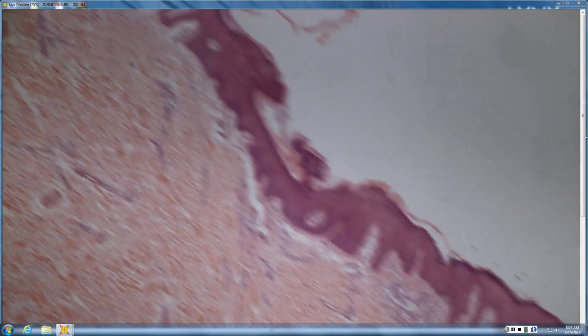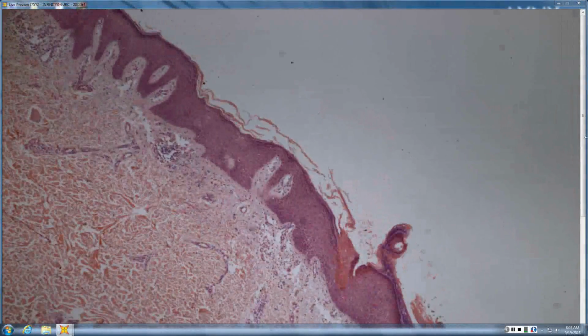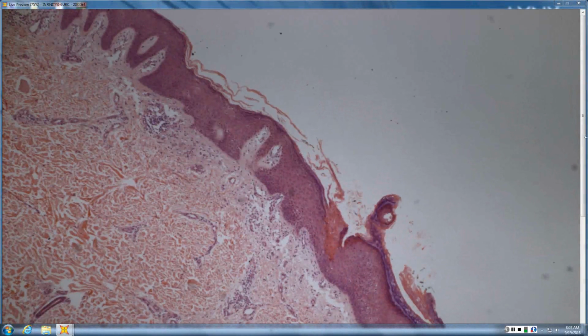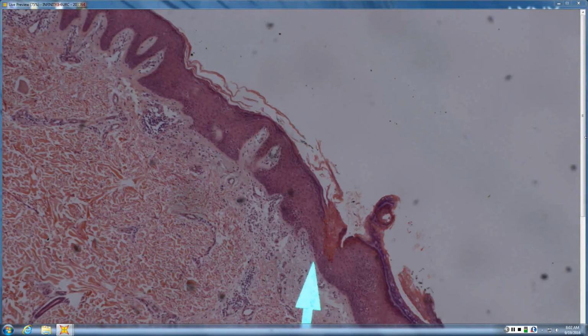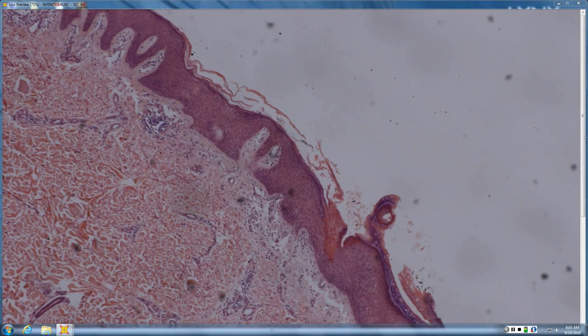Looks like a pretty big specimen here. Or punch biopsy. The horn kind of varies a little bit. There's like some follicular plugging there in the middle. Another cornoid lamella, perhaps. So you did it exactly the same as you did last time, where you started with follicular plugging, then you noticed all the dead keratinocytes and the angle, and said porokeratosis. Very good. And we're going to keep giving you poro until you know.